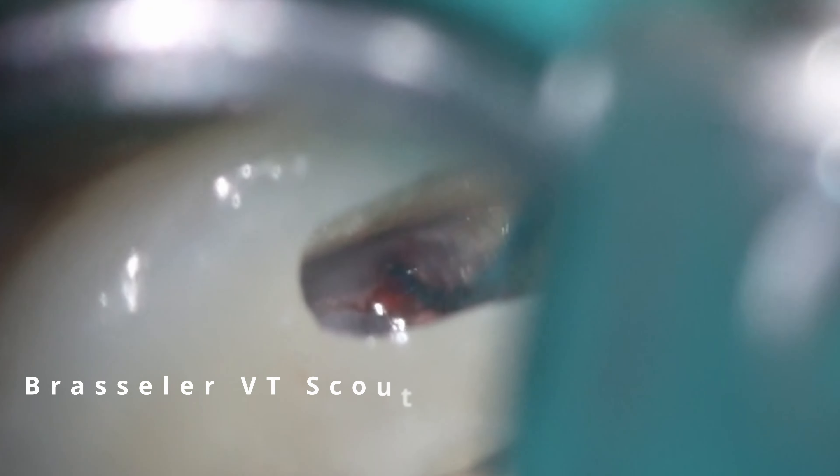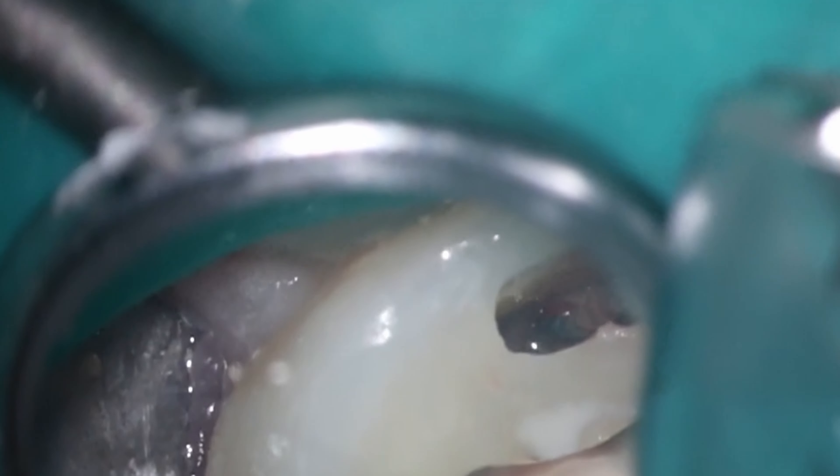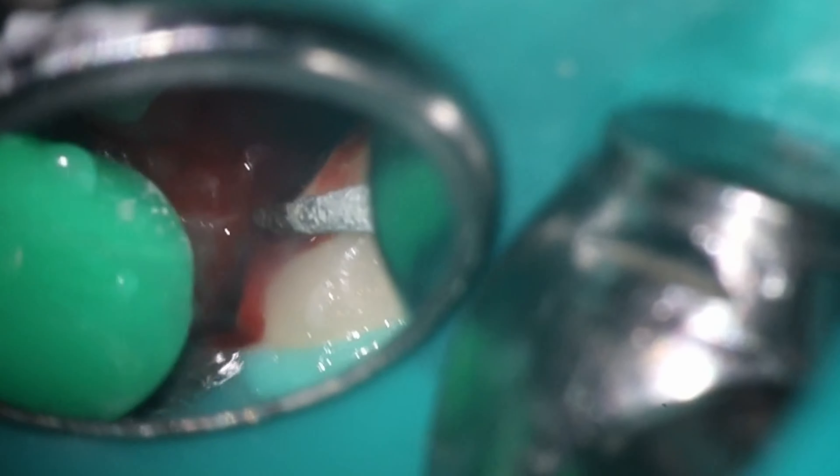Now that we've found a little bit, you can see the 6C file drops inside there, but not very far. This is not a wide-open case. I'm going in here seeing if maybe the 17-04 will do much for me, and it really doesn't grab too much. The key with these curved canals is you don't want to push apically at all, because your risk of breaking the file is very high and your ability to remove the file is very low. What I'm going to do here is try to use the 20-06. We want to switch between tapers — the 06 taper is going to work a different aspect than the 04. MB1 is looking great; we're down at about 18 millimeters.